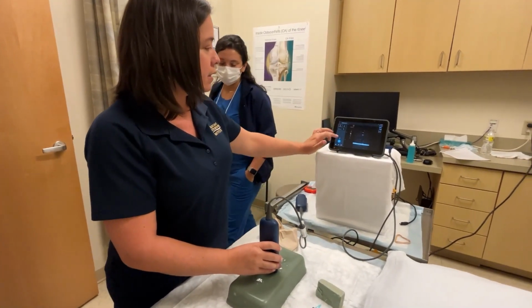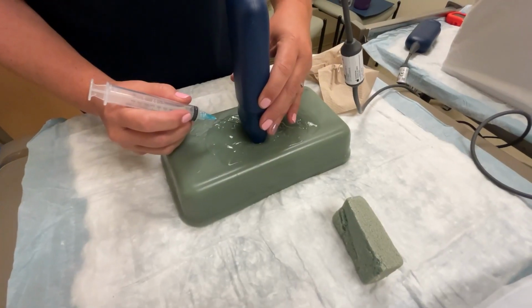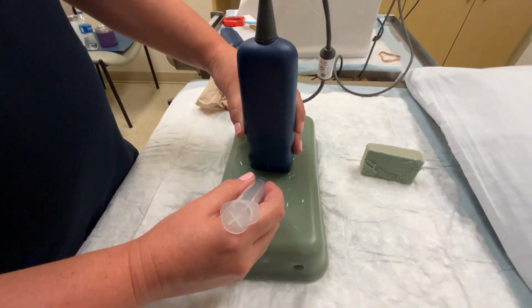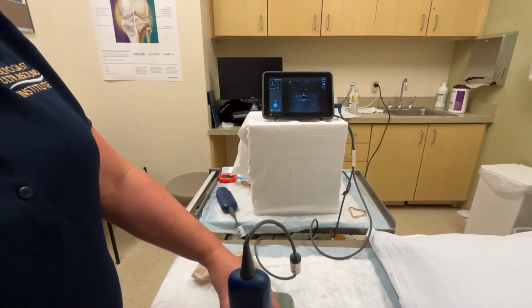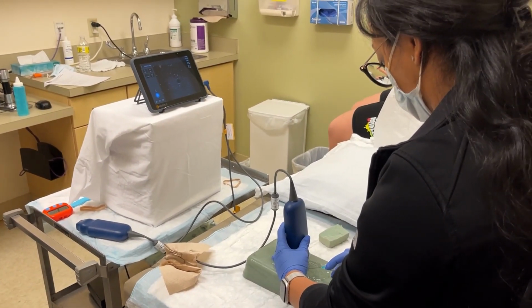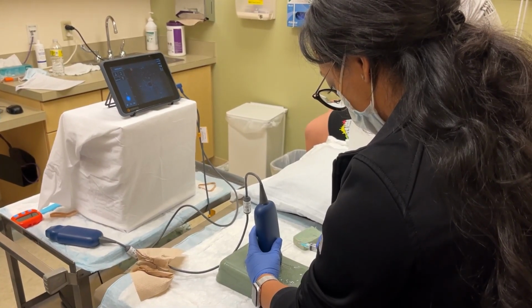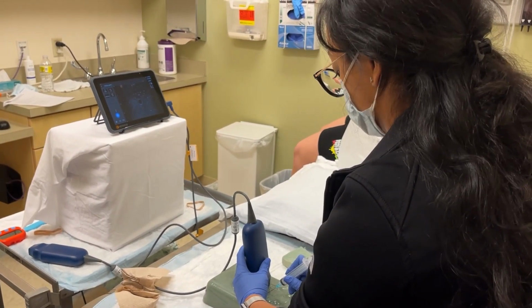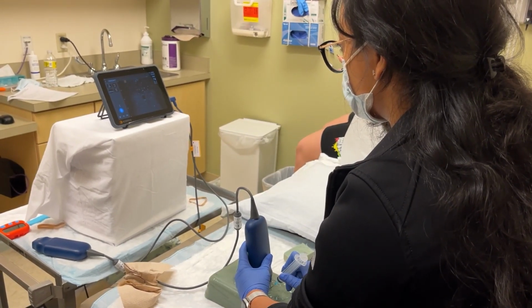So there it is. Let's decrease our depth. See the line on the transducer right there? So we're going to put that there. And I'm going to kind of take a steep angle. Vessel center. Find your center line with your needle. Come in at a little bit more of a steep angle because you're going deep for jugular. Insert the needle straight until you see the tip on the screen.